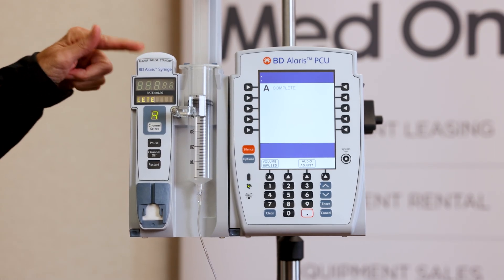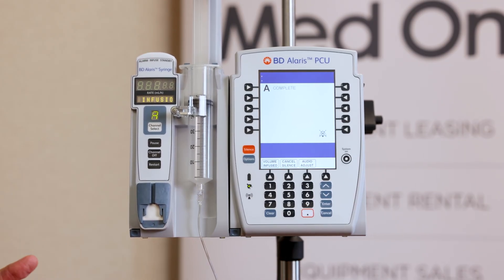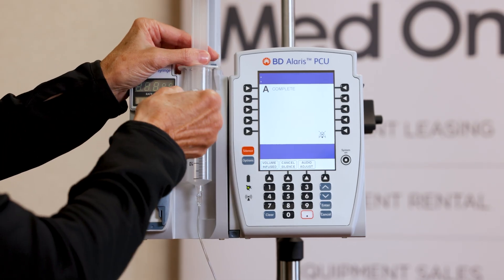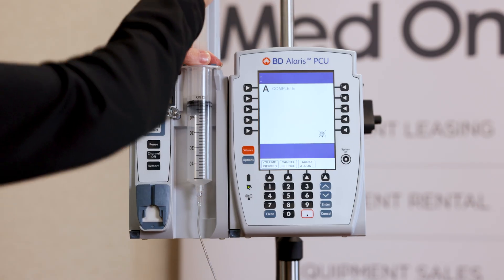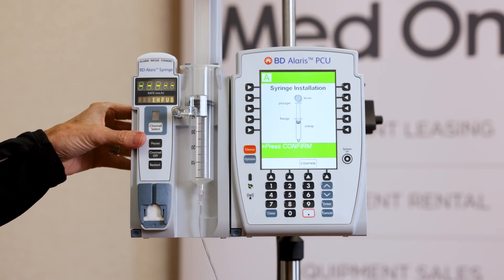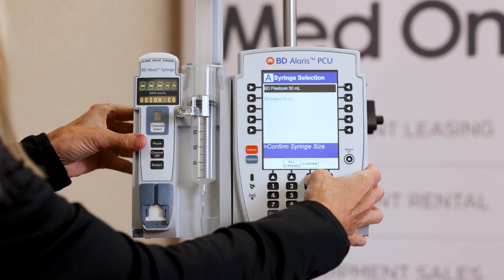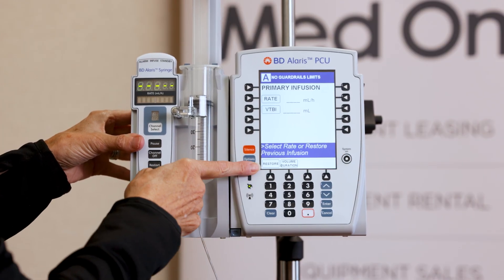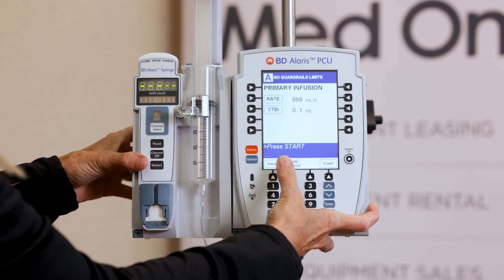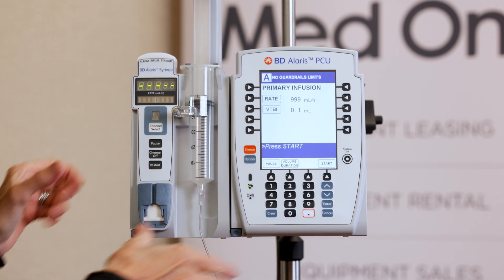This is an alarm — red. The infusion is complete. You can press silence. If you have a subsequent syringe with the same rate and volume to be infused, you channel select, and you always have to confirm your syringe and that it's loaded correctly. See this restart button — this has a memory of seven hours and 59 minutes. Had I not manipulated these numbers, the rate would have still been 25 and the volume would have been the exact volume that was in the syringe.